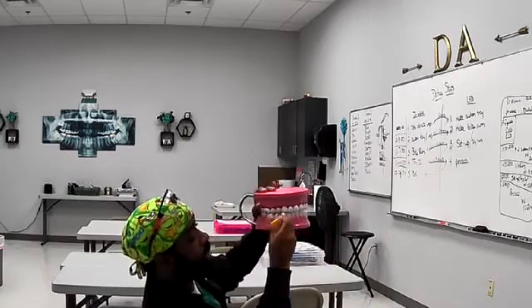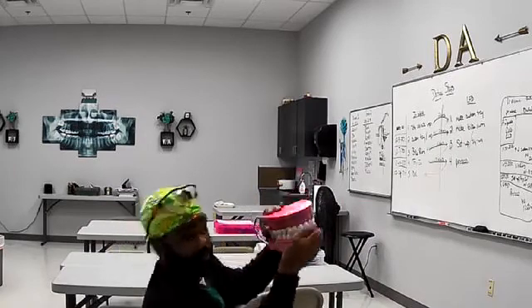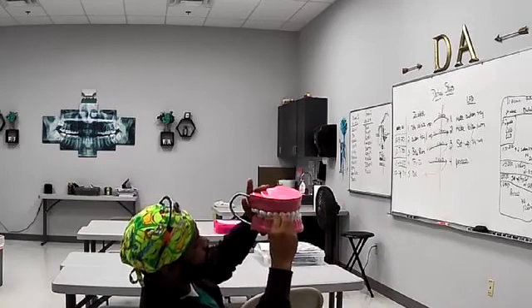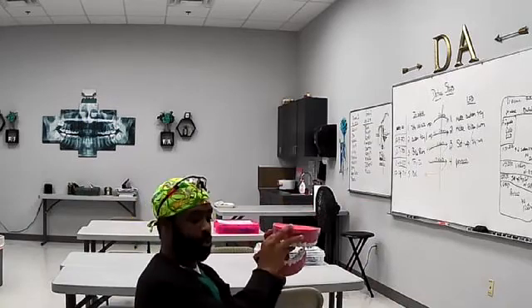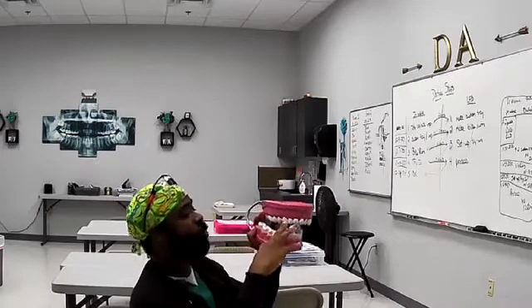Now you need to come back and start taking PAs of every other tooth. Being that this is through the posterior, put that sensor back there, take your upper posterior, and you literally just go around the mouth. You don't have to take one tooth at a time.